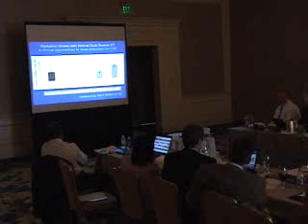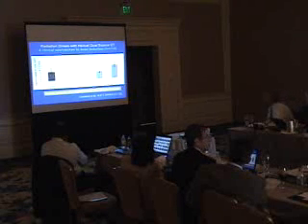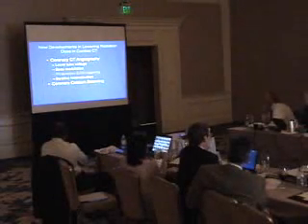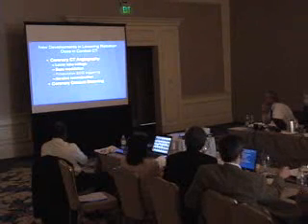And what we were able to achieve is that in smaller patients with a regular rhythm, we had an average dose of 4.4 millisieverts. So you can see we're starting to get down to very low levels, approximating those that Dupree suggested would be needed for a screening test.